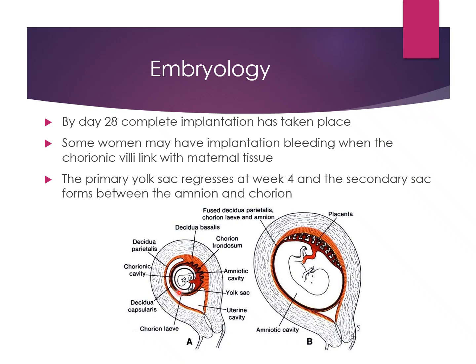We definitely should see the amnion, and we definitely should see the yolk sac. We're not going to see something this developed in that first 6-week ultrasound, but we're definitely going to see that yolk sac, and that yolk sac is almost always the first identifiable thing next to the gestational sac that we're going to see on ultrasound that indicates signs of pregnancy.